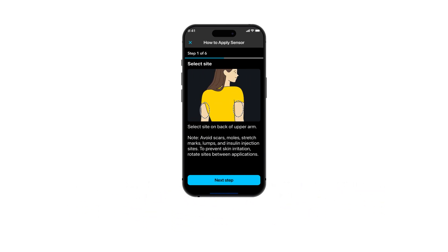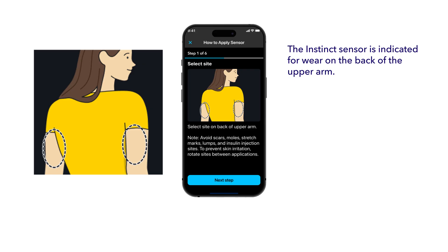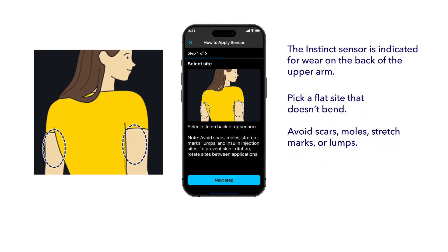Choose your insertion site on the back of your upper arm. Select an area that is flat, free from scars, moles, or stretch marks, and at least one inch away from insulin injection sites.